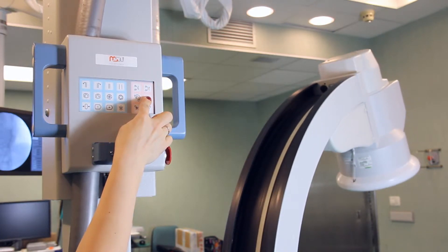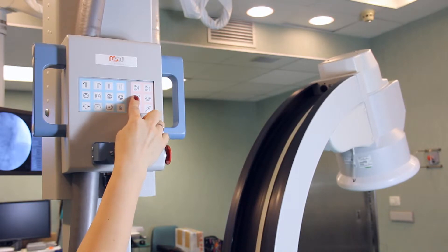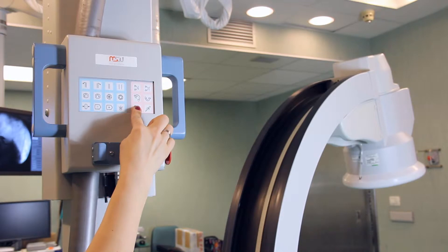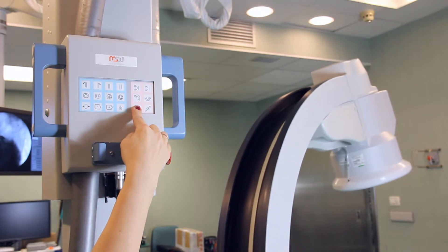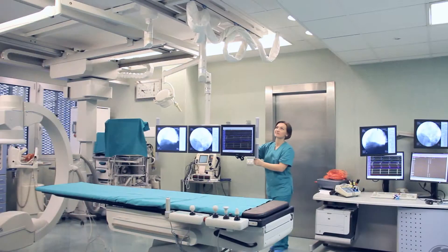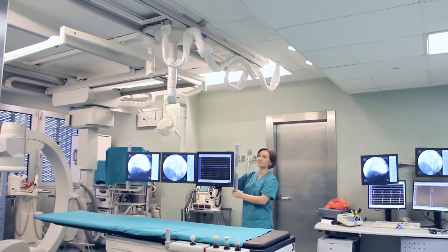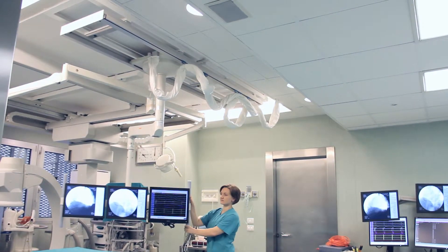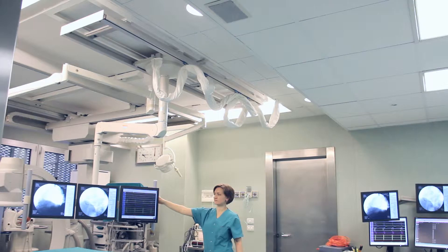The C-arm moves up and down, rotates orbitally, and turns laterally. Monitors in the operation room are attached to the ceiling and can be placed in any position convenient for a surgeon.